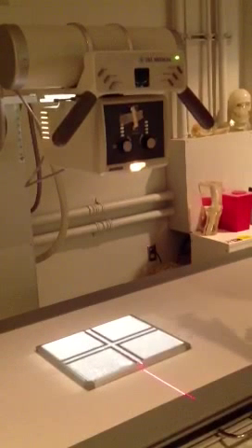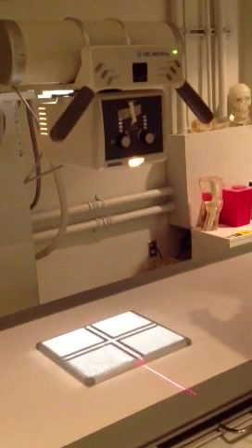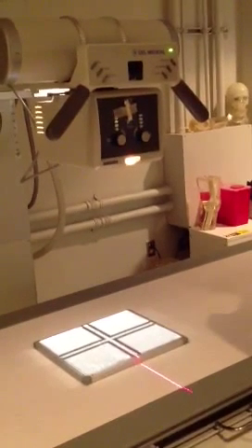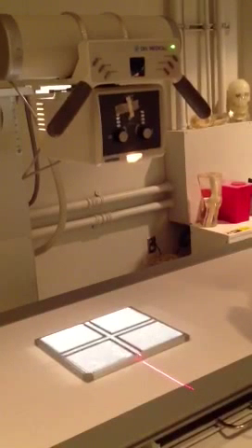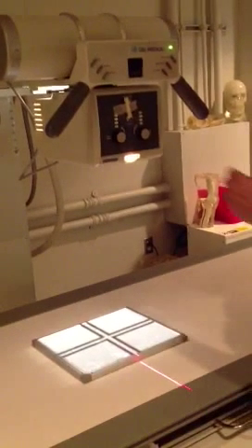That's where we want to manipulate the exposure going through the patient in order to get diagnostic quality film.